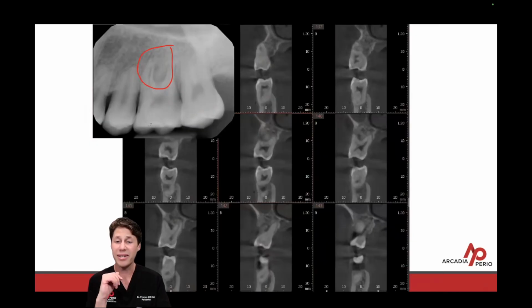So here we are at 6 months. I could not believe the regeneration results at 6 months. It's typically unlikely to see this much regeneration this early on. Remember, when we probe at 6 months, our probe depths typically precede any radiographic changes. So just something to be mindful of.